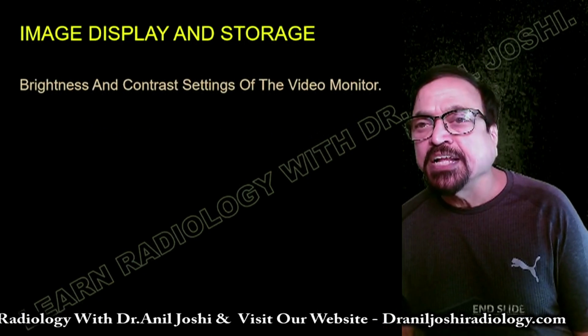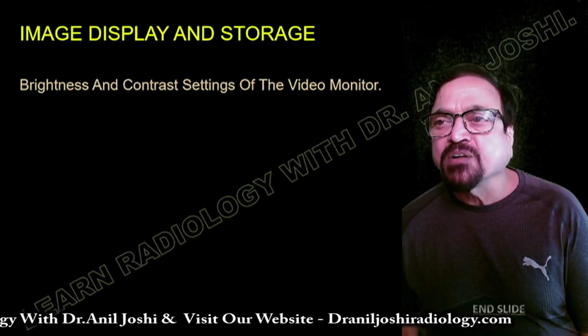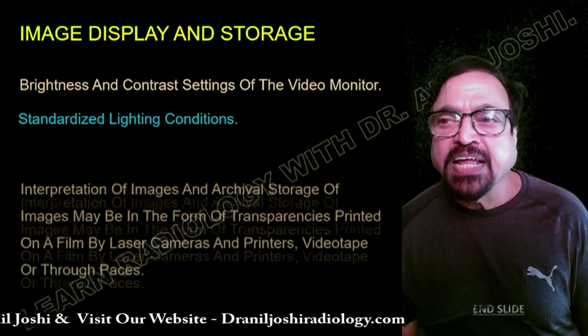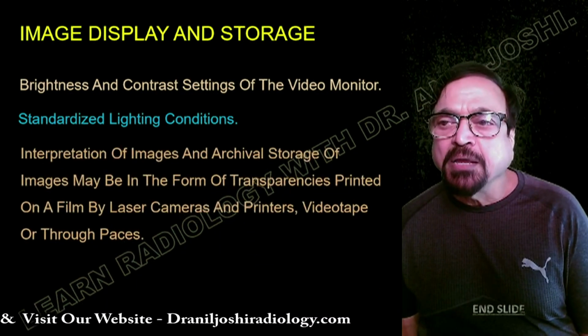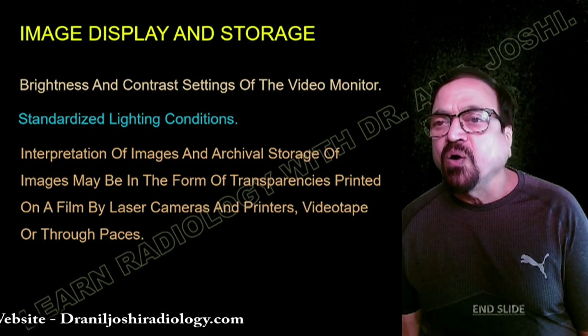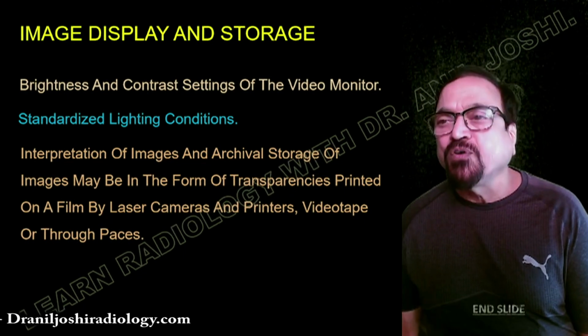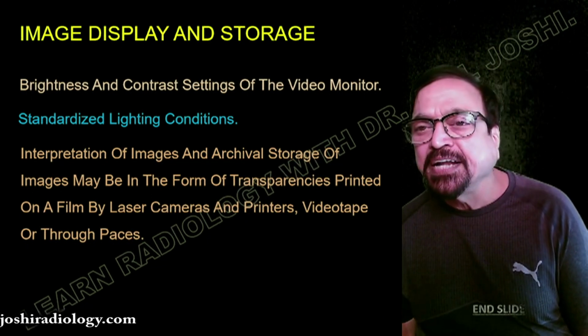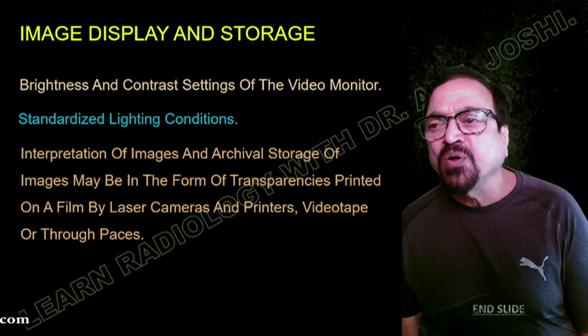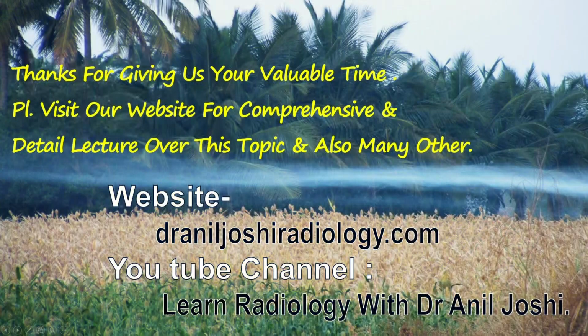Now image display storage. The brightness and contrast settings of the video monitor are standardized according to the lighting condition. Interpretation of the image and archival storage of images may be in the form of transparencies printed on film by laser camera and printers, or videotapes, or through PACS.